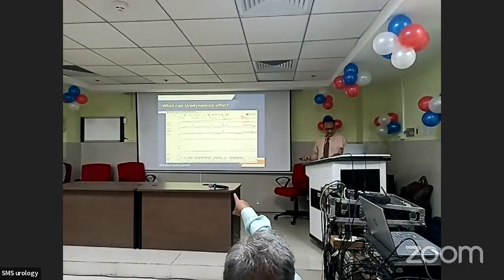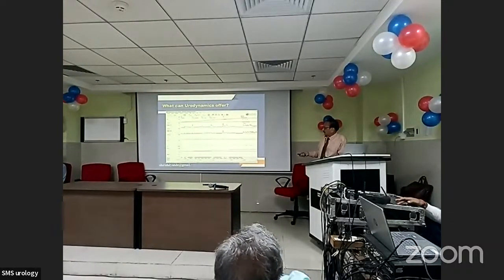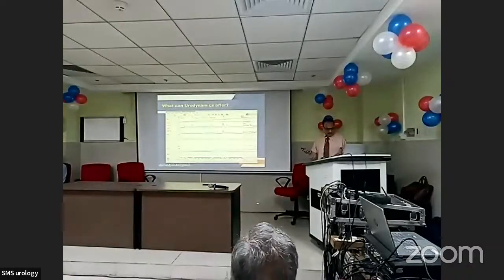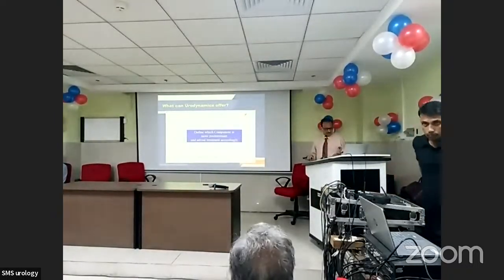and physical measures. In this particular graph, how do you say this is not a cough-associated detrusor overactivity? This could be the cough-associated detrusor overactivity. Yes, this could also be cough. This one could be, and even the dimple also. Absolutely. Thank you. So, define which component is more predominant and treat accordingly.